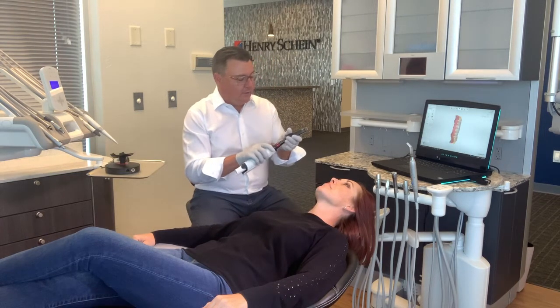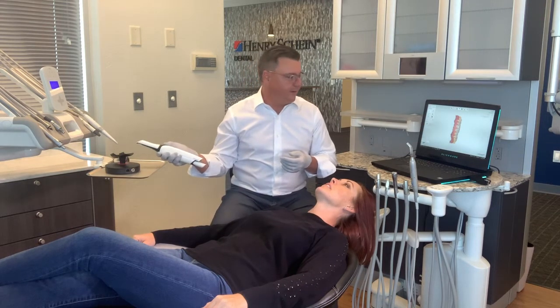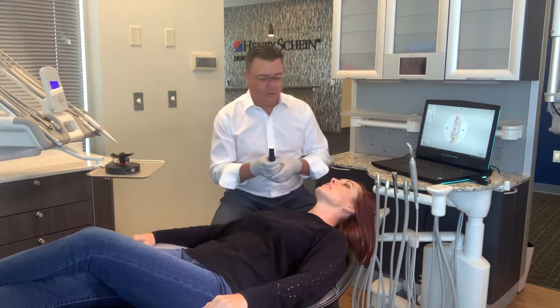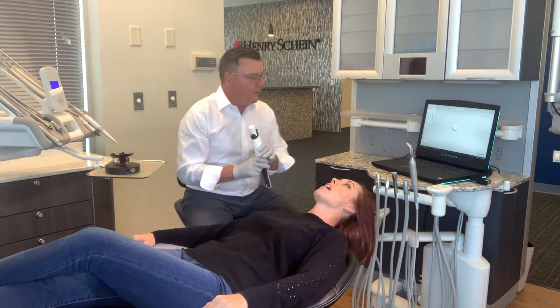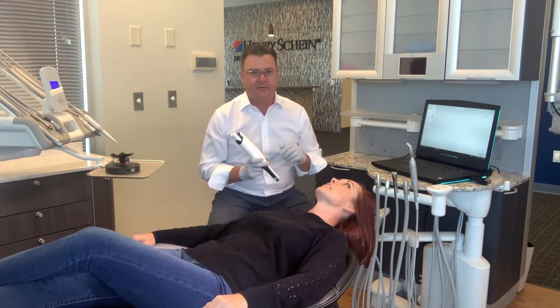Now what I'm going to do is move on to correlating the bite. Click of the button — this time I'm going to point to the right and we're going to go into the bite section. We're going to take two bites on this patient, one on the right side and one on the left side, to make sure it's as accurate as it can be.